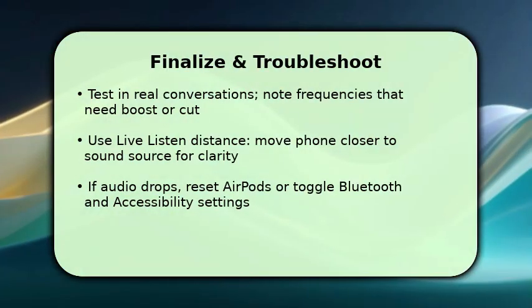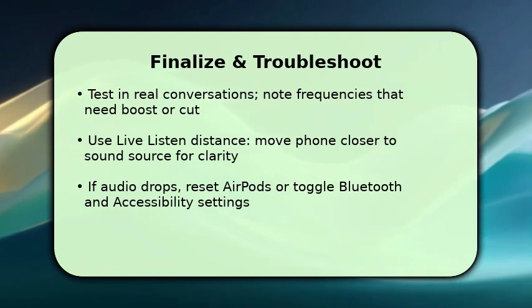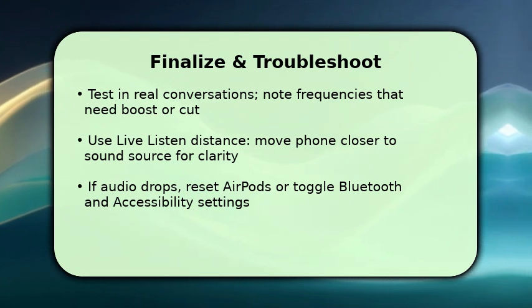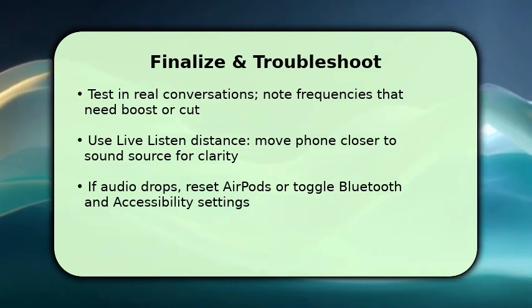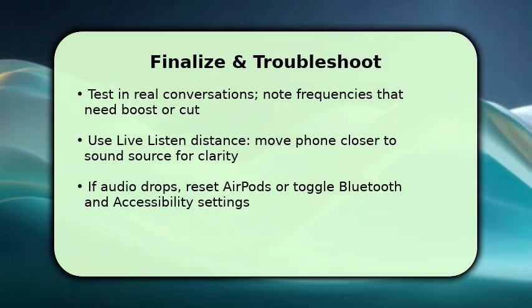Finish by validating the setup in actual conversations. Listen for missing consonants or distant voices and tweak headphone accommodations accordingly. Make sure you position the iPhone toward the speaker and keep it 1 to 3 meters for best Live Listen pickup. Moving the phone closer helps.